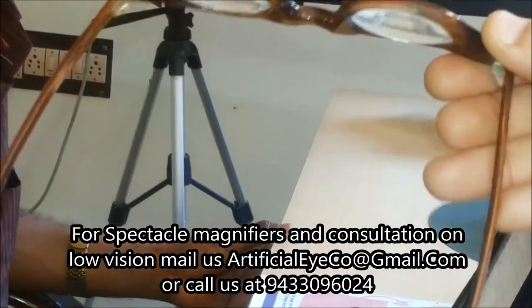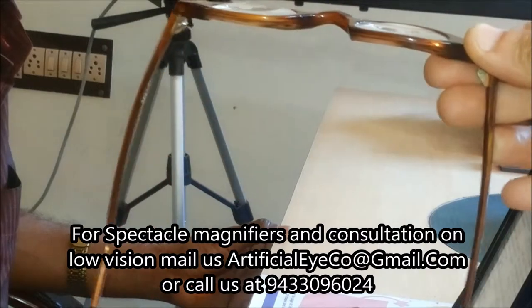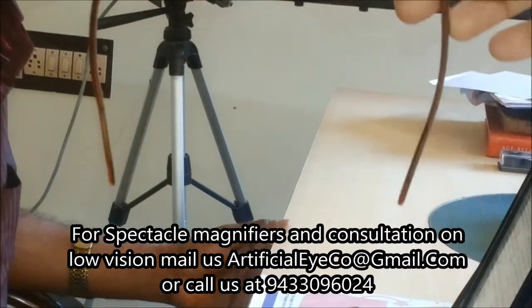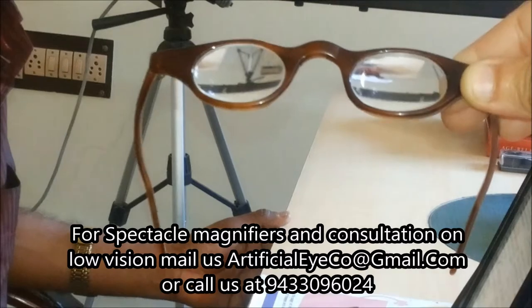This is also one type of low vision spectacles. Most patients want something in the form of specs, so this is one of the types of spectacle low vision magnifier. It is specially used only for reading — from this you cannot see distance or your computer.